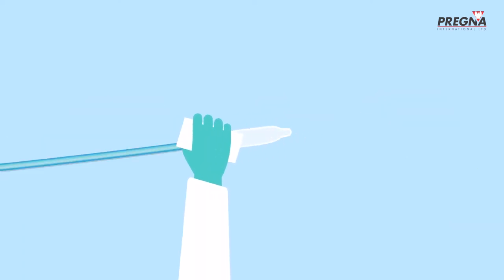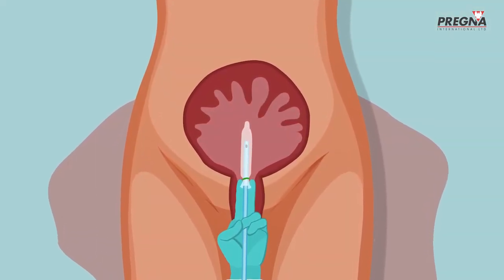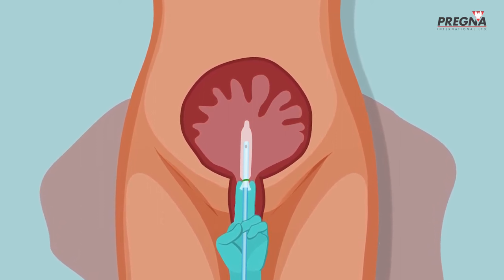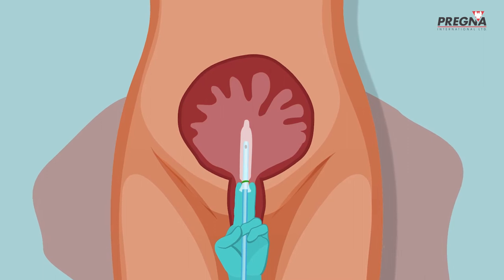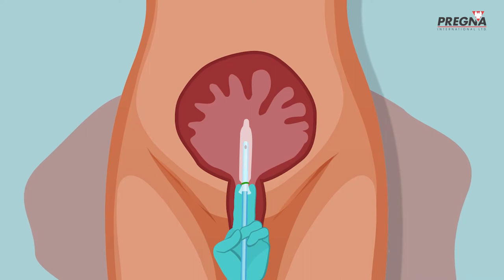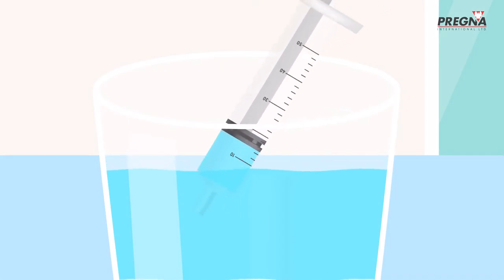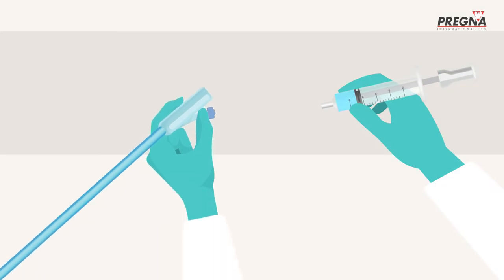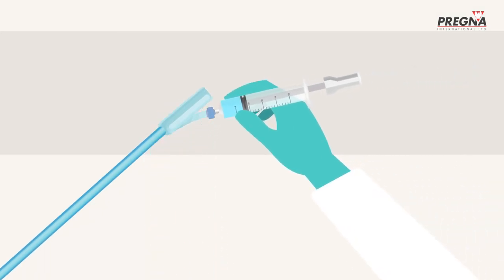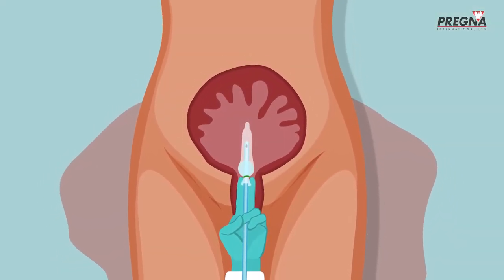She disinfects the balloon using the iodine wipes provided in the kit. She inserts Dr. Burke's ESM UBT into the bleeding uterus, making sure that it is inserted through the cervical opening and into the uterus and not just in the vagina. If the balloon is inflated in the vagina, it may not address bleeding from within the uterus. She draws normal saline into the syringe and attaches it to the catheter at the opening used to fill the smaller Foley balloon, then pushes 15ml of normal saline through the catheter into the Foley balloon.